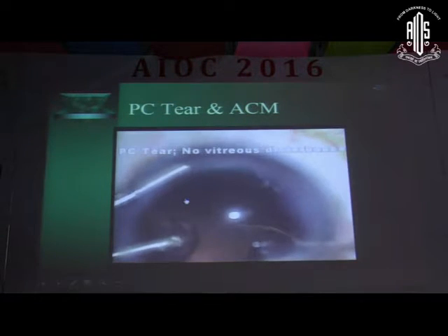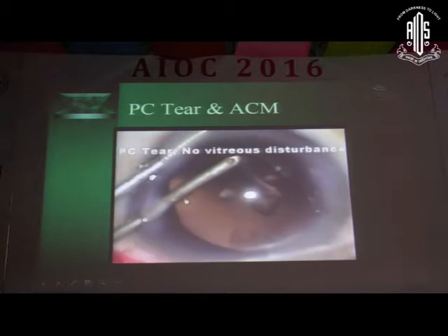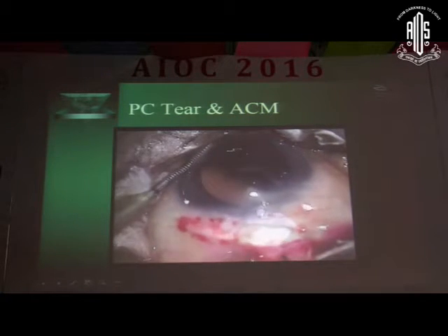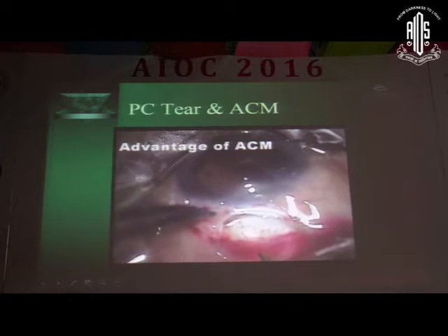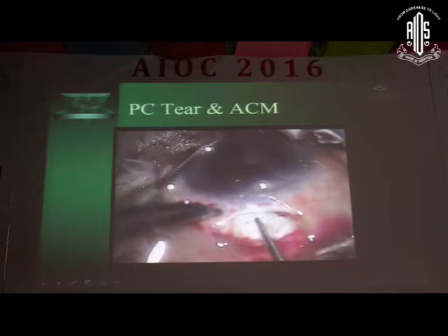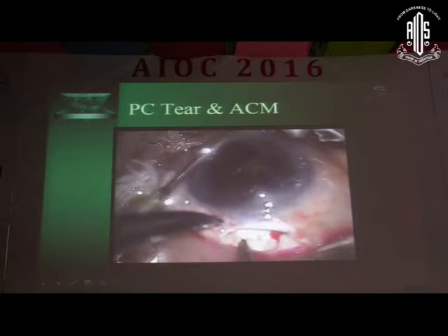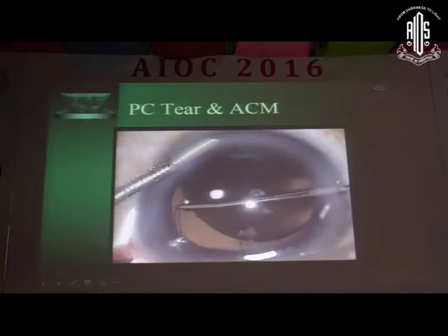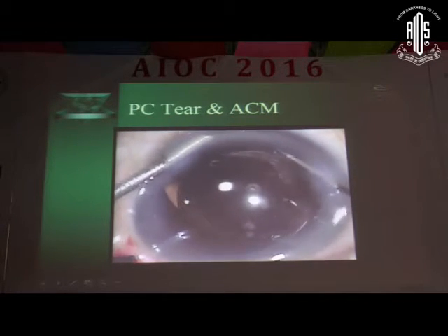Now here is a case where again there is a PC tear you can find, but the vitreous face is not disturbed and I could continue with my cortical aspiration and all the steps of the surgery. These steps can be very hazardous and you have to be very careful during these maneuvers. Otherwise, it is best to use viscoelastics, at least in such cases, unless you are very expert in SICS. Now here the cortical matter is aspirated, the vitreous is not disturbed and gently the lens is placed into the ciliary sulcus. This was a case of PC tear without vitreous disturbance.